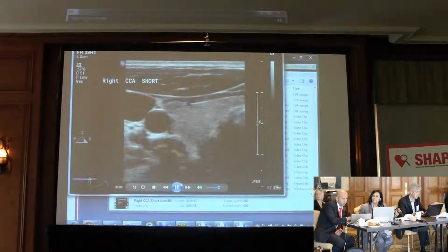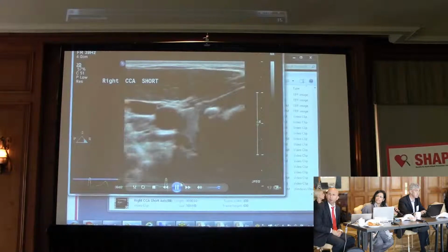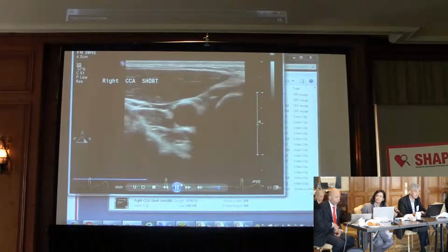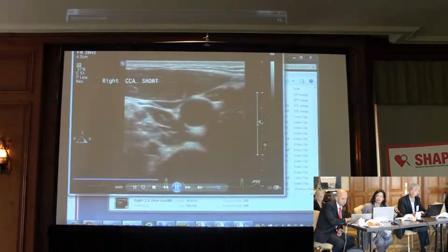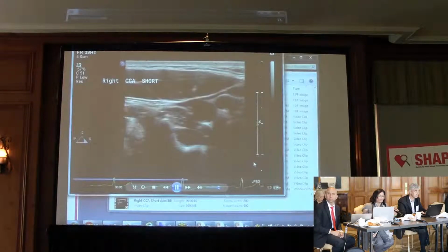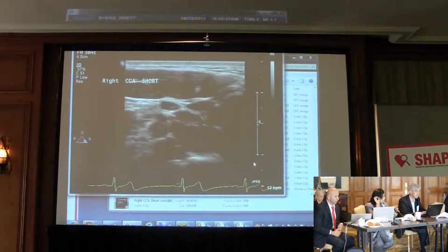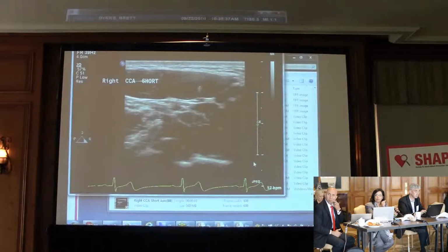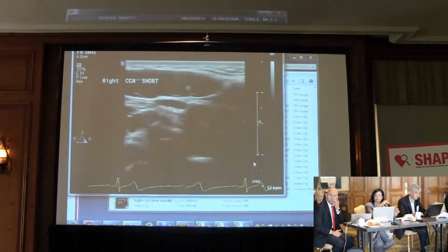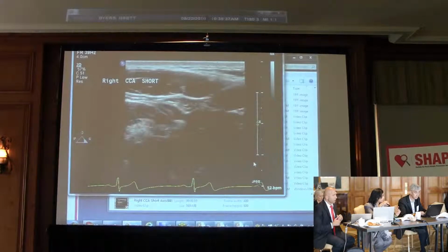So here is another patient. This is a trial that we did. We took people under 50 who presented with acute MI. Actually, this is not the one. But again, just to show you that we are able to see the entire vascular bed, and this was done already like 3-4 years ago, and a novice can be trained to do this. So if you move away from IMT and just focus on plaque, and how many segments have plaque, what's the plaque thickness, we actually can come close to characterizing the plaque burden if we include another vascular bed besides carotid.